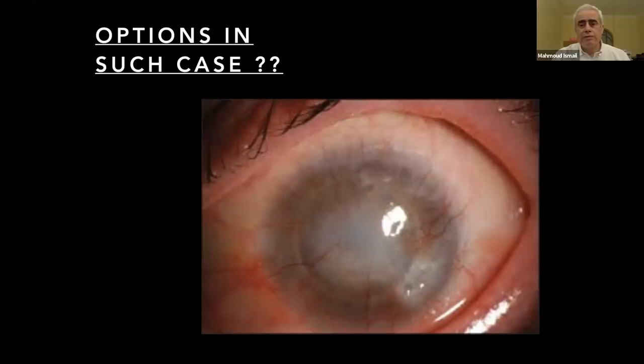The corneoscleral graft is done in cases of anterior staphyloma. It's a heroic surgery, Dr. Hossam, and it's not as easy as you think because the patient will develop glaucoma in 100% of cases. Corneoscleral graft is more or less the last chance for patients who are suffering from huge anterior staphyloma. But in normal cases like this, nobody will do a corneoscleral graft. And in a case like this, you have to wait a lot of time before evaluating because the eye is still active, not quiet yet.